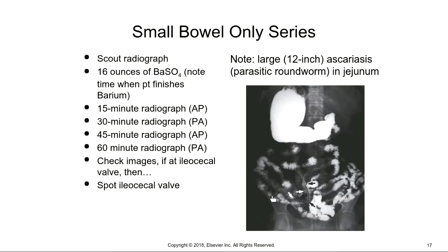Brought the patient back at 8 hours, still hadn't reached it. So they actually took the patient home and told them to come back the following morning for a 24-hour image. And finally, at the 24-hour image, it had just barely reached the ileocecal valve. So everybody's a little different. I've seen some patients that after the 30-minute film, it's already going into the large intestine. So everybody is completely different. And again, it depends on what's going on with your patient.